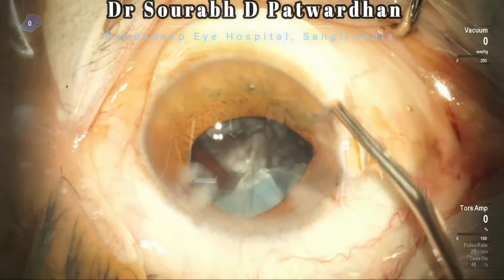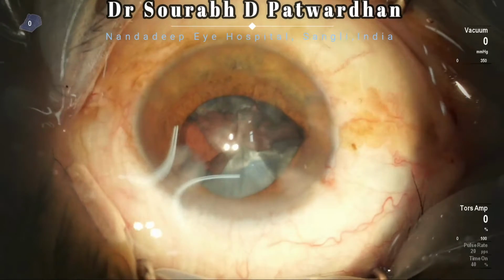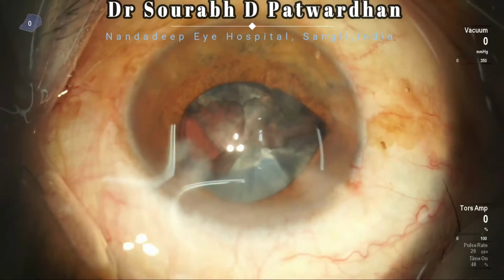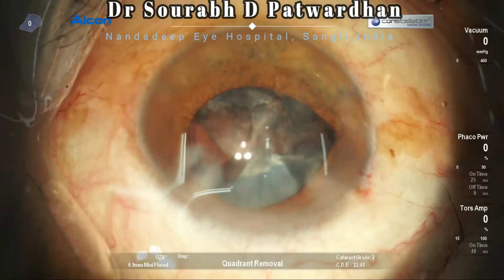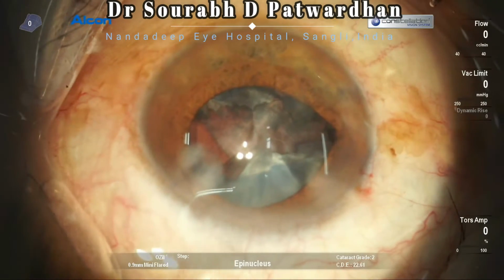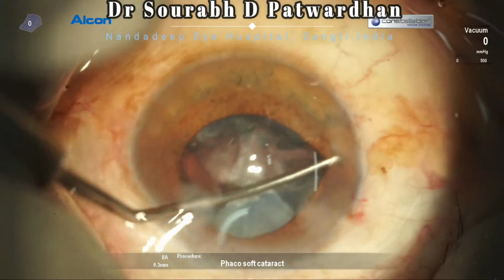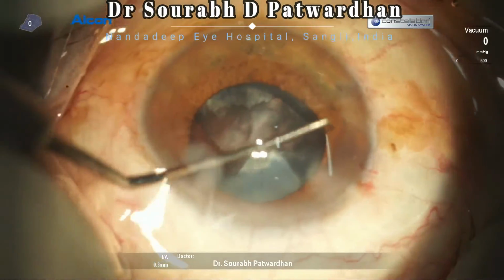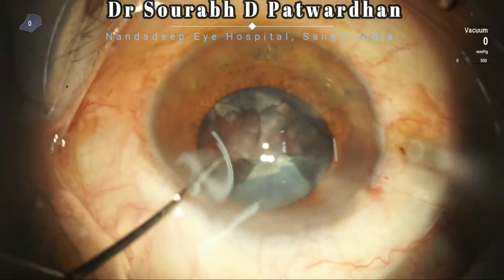Now here you can see a small capsular tag has come into the incision along with the probe, but this is not vitreous, it is just the torn capsule. So I used my Sinskey to pull it down because I don't want it to get caught again when I am introducing the coaxial IA probe.